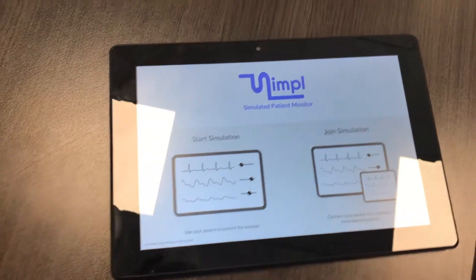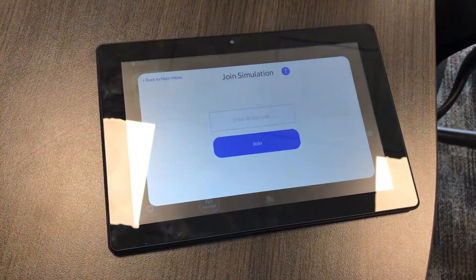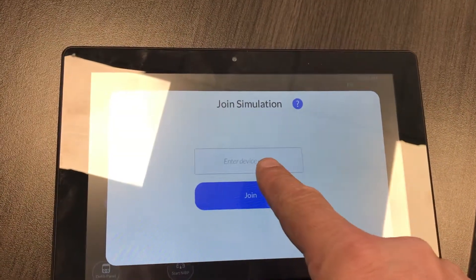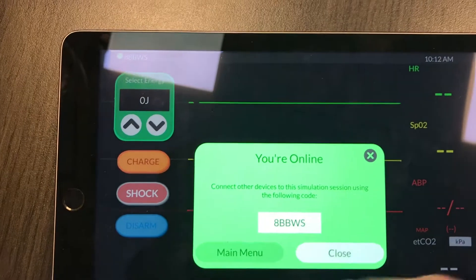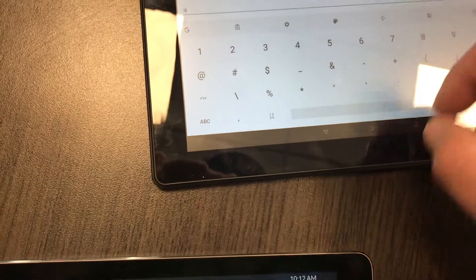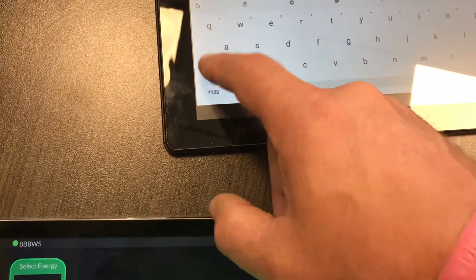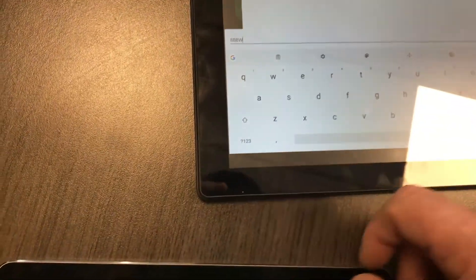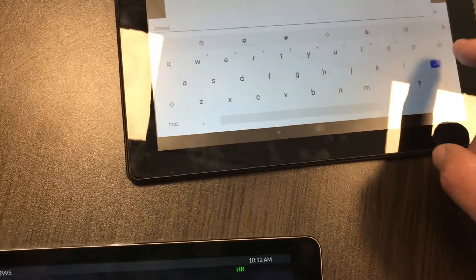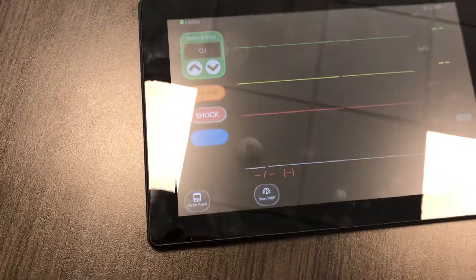As this is booting up, you will see that you want to join a simulation because you already started one. Go ahead and join that and it'll ask you to put the code in. We'll go ahead and put that code in as seen on the other iPad — it's 8BBWS — and they are case sensitive, so you need to make those capitals. In my experience they've all been capitals. Go ahead and type this in, hit Join, and voilà — both iPads look the same and you're on the same simulation.